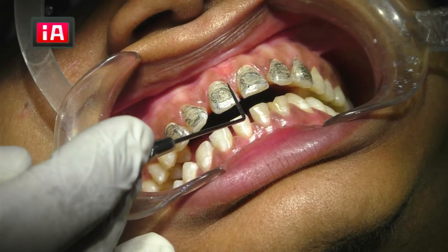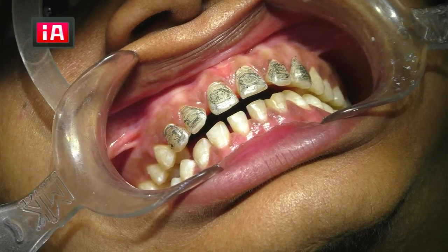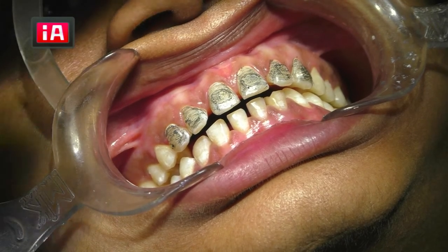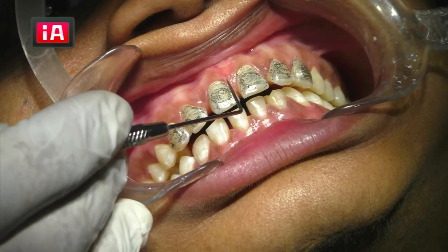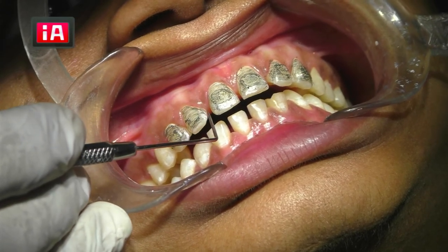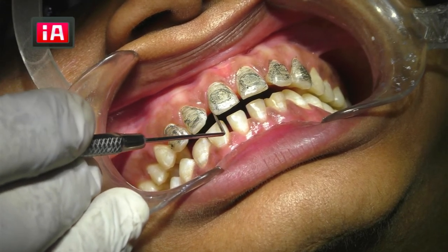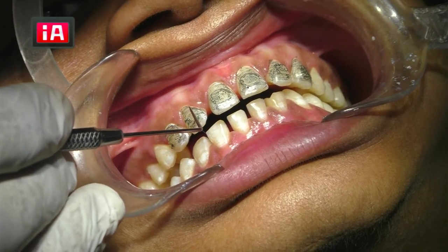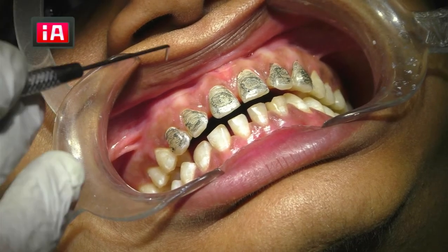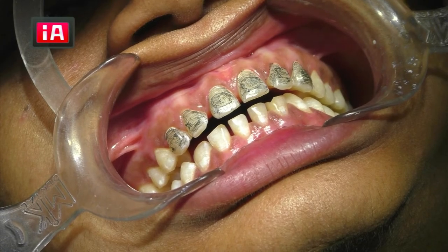This is the only difference between the preparation for a diastema closure and a normal laminate or veneer. In a normal laminate or veneer, where there is a tight contact, you should not break the contact. Here, because there is no contact at all, the laminate will wrap the tooth so that it can close the space and create the contact. That is the main key in diastema closure using an indirect veneer.